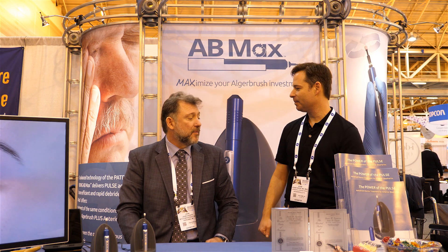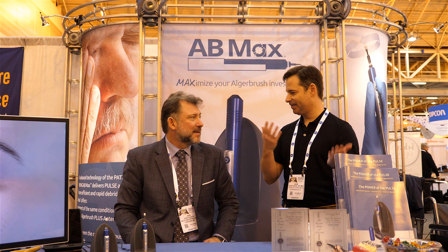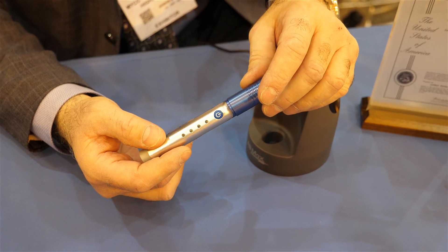Thank you for letting me be here. So, do you want to give people just a little background on the product, where it came from, and tell people what it's all about? The AB Max is a brand new product that was designed to treat anterior blepharitis.